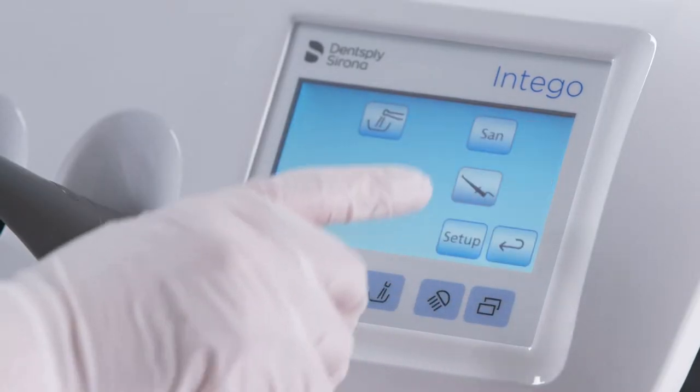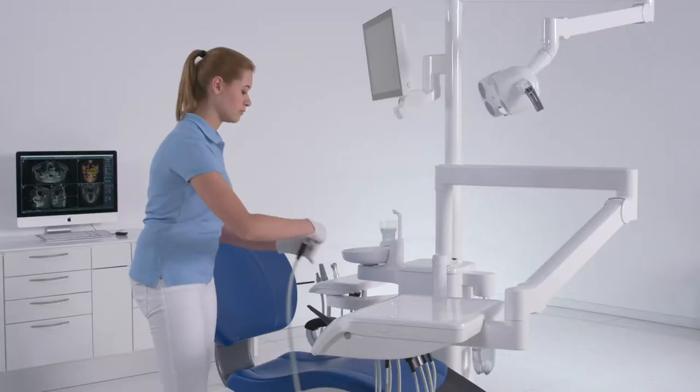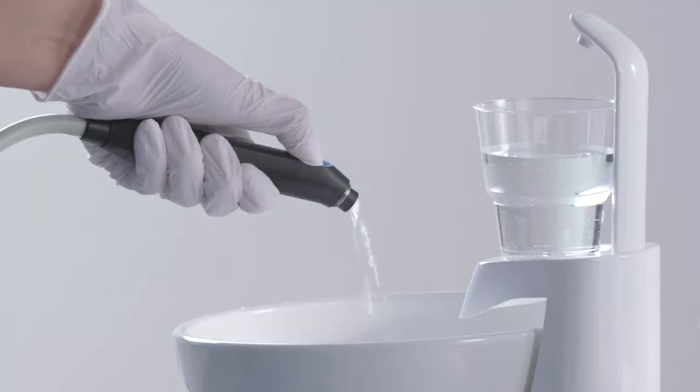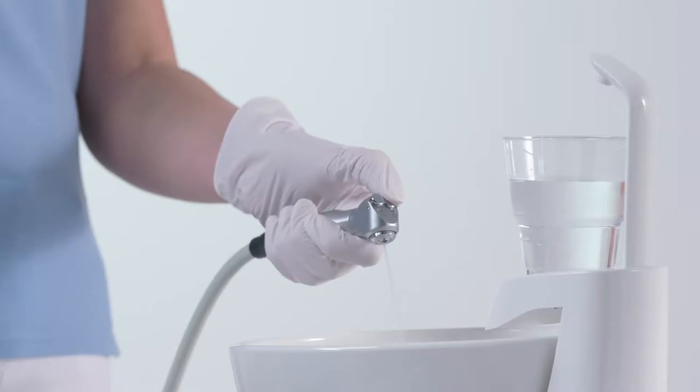Activate the sanitation function in the sub-menu of the Start dialog. Hold the syringe of the dentist and assistant element over the cuspidor and press the water key for at least 15 seconds.